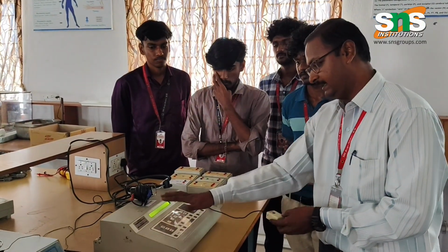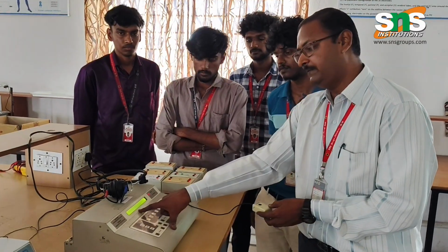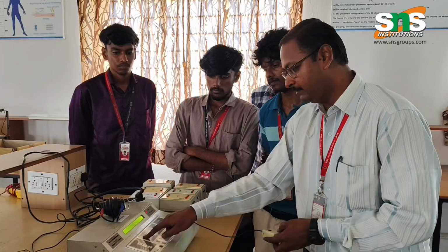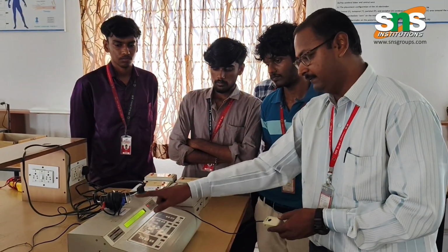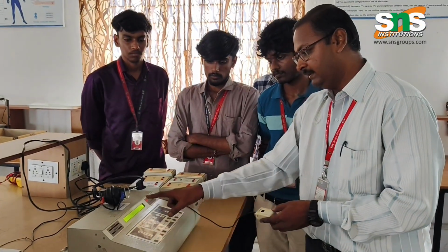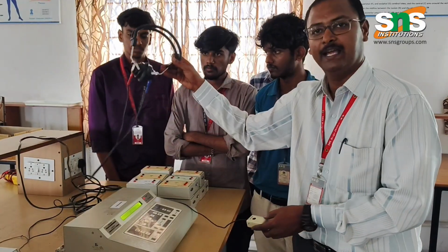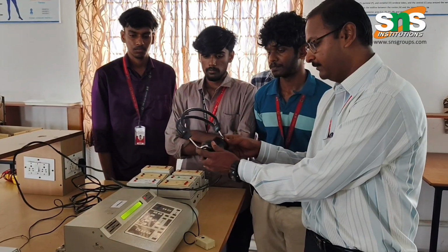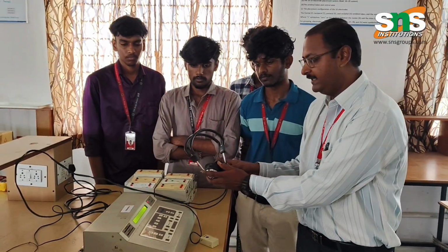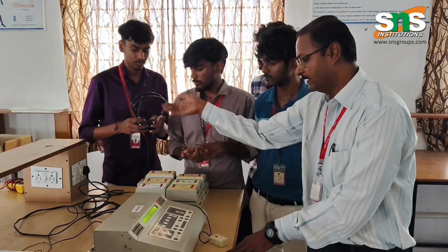So here we have a setup. You can see that this equipment has two different kinds of tests: one is air conduction, another is bone conduction. Here we are going to do the air conduction test. We have selected air conduction first by selecting the particular module, and the stimulation is given to the patient through this headphone. Through this headphone we can differentiate the left and right ear separately. I have given this headphone to one of my students to wear.